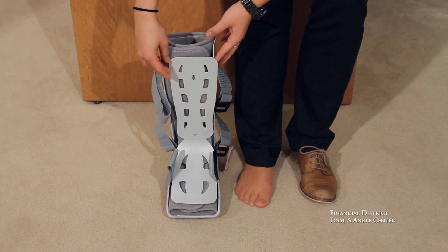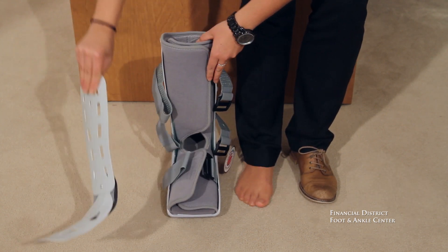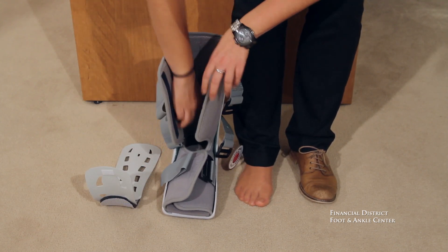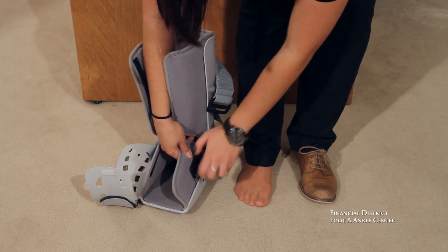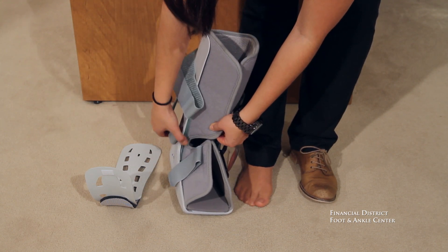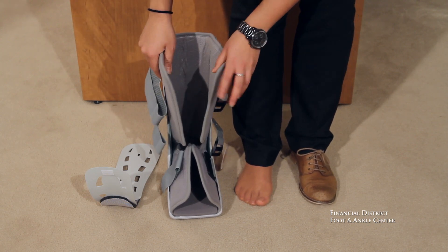When you're putting on your air cast, you want to remove the front piece after you have unvelcroed the three straps. Then you open it up, and you can see here that there are air bladders that run along the side, both on the outside and the inside.